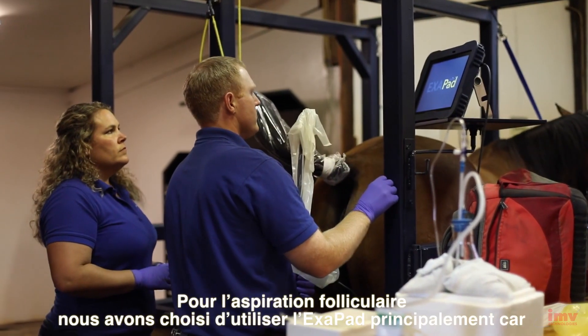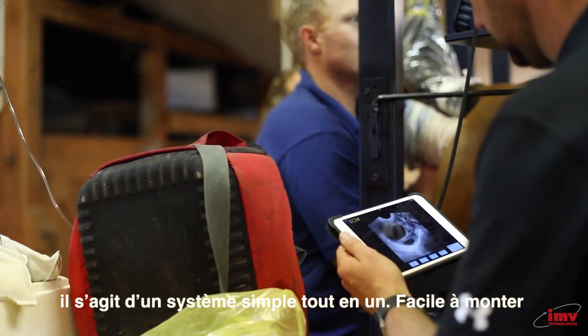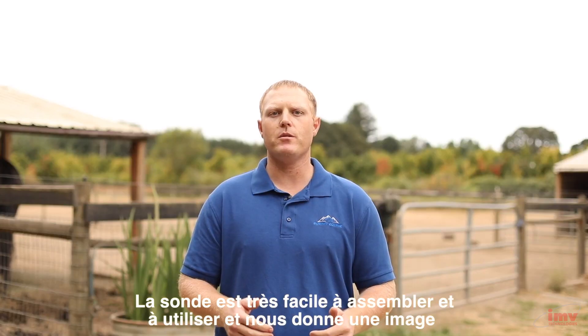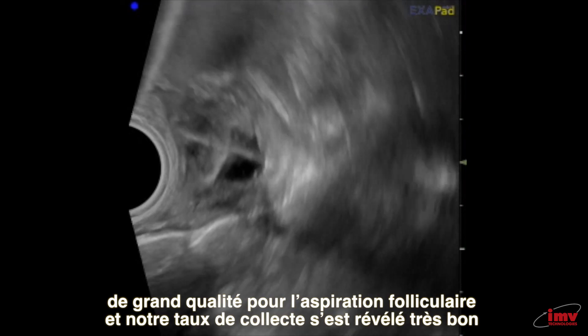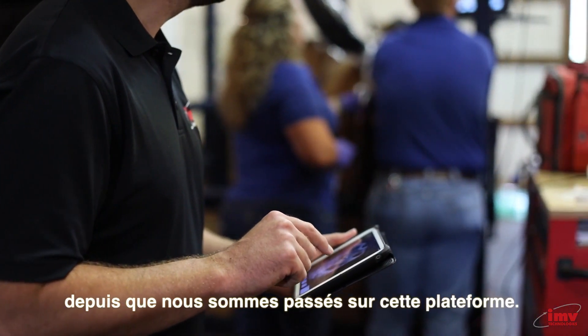For oocyte aspiration, I've elected to use the ExaPad mostly because it's a simple standalone system. It's easy to put together, has one probe that's very easy to assemble and to utilize. It gives us a great image for follicular aspiration and our recovery rate has been very good since switching to this platform.